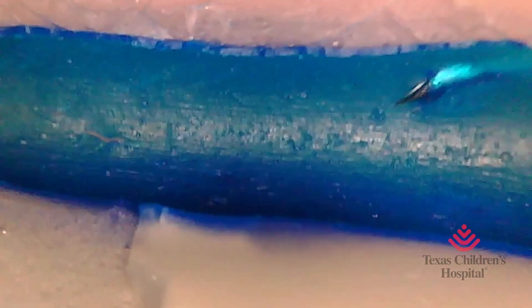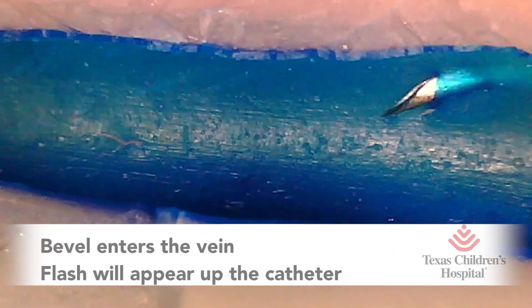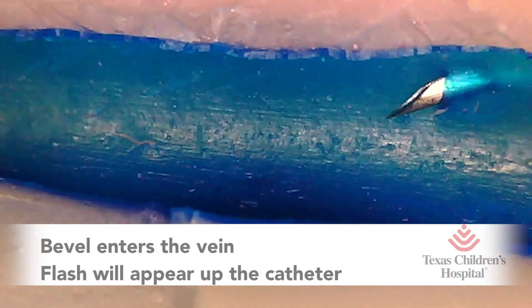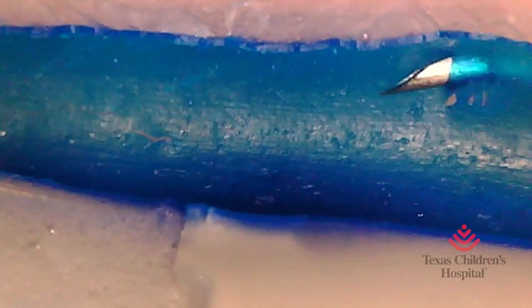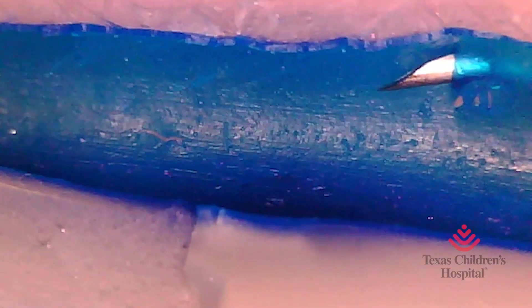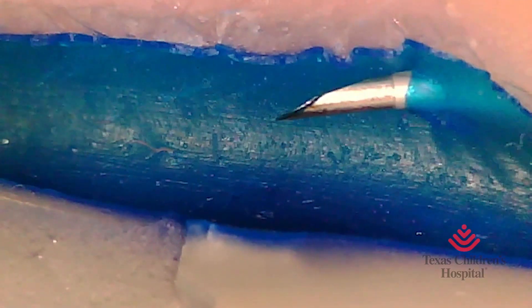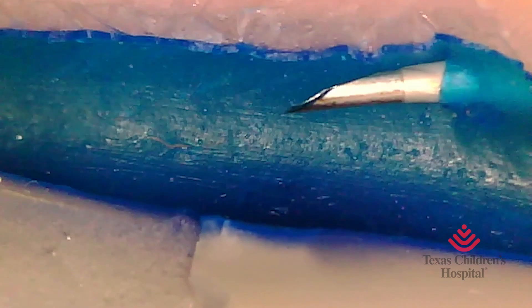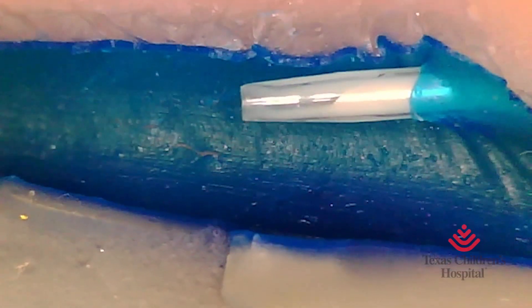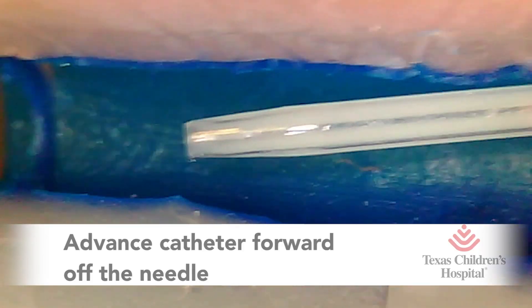Let's watch what goes on during normal catheter placement. The needle enters the lumen, the catheter enters the lumen, and the catheter is then threaded into the lumen.